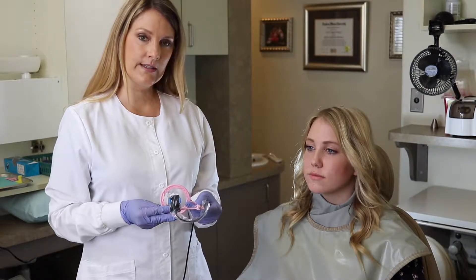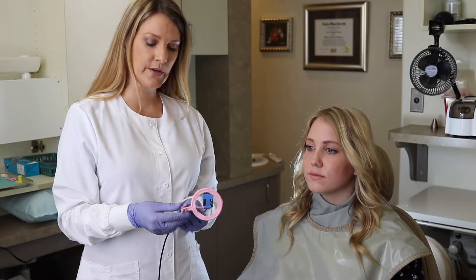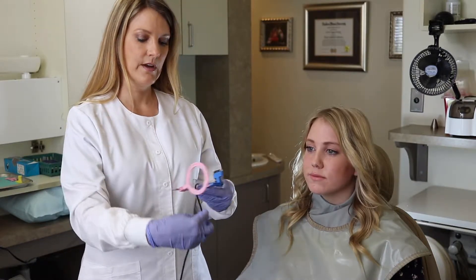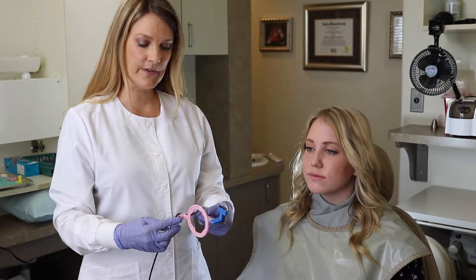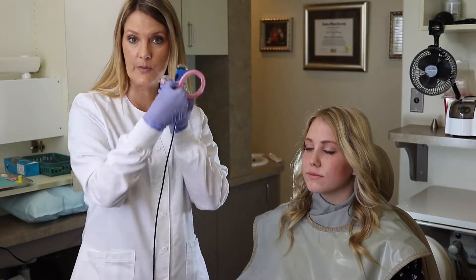We've placed our Dentimax Dream Sensor into the anterior bite block and we're now ready to take our anterior position x-rays. We're going to wrap that cord softly around the rod and then go ahead and position it.